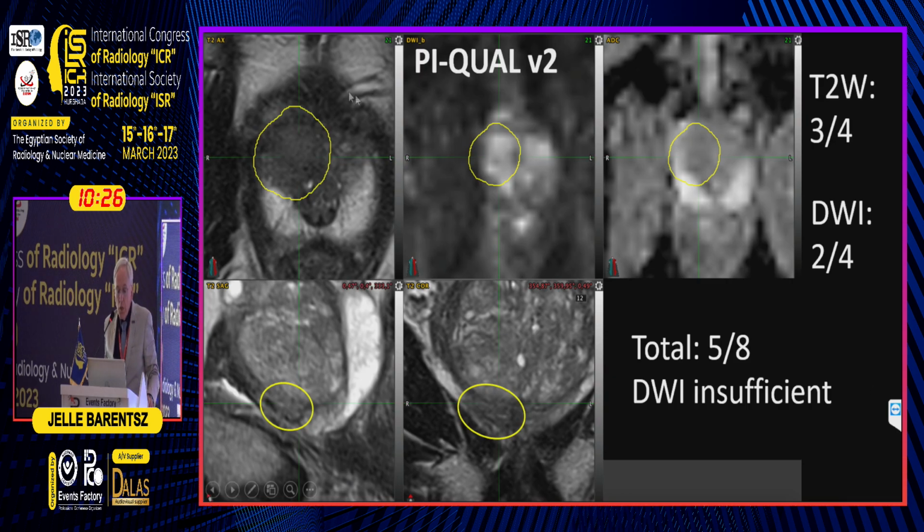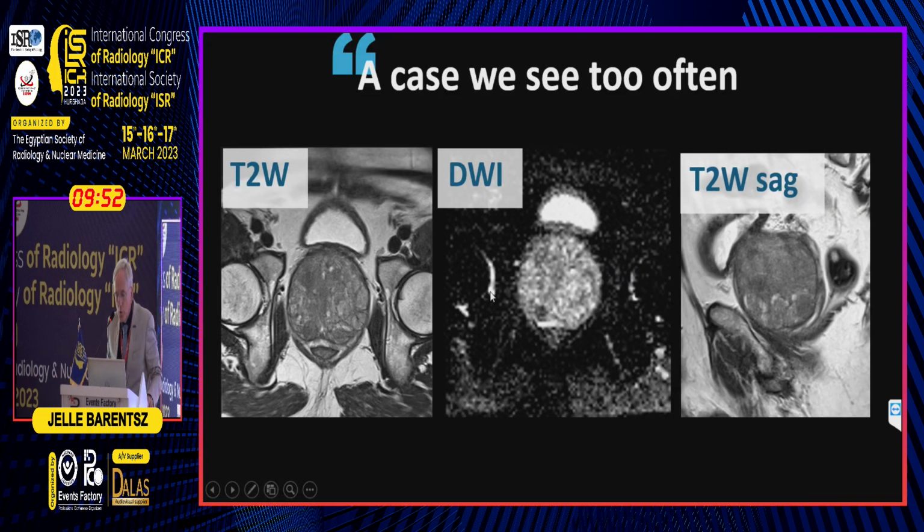An example, you can see over here that it is a little bit blurry due to motion artifacts on T2. The coronal and the sagittal images are not that sharp, so T2 will earn 3 out of 4. However, there is not a really bright area of this tumor here as compared to the rest, and there is not an optimal delineation of peripheral and transition zone, so 2 out of 4. That means that the DWI is not sufficient, and in this examination, contrast was not performed.